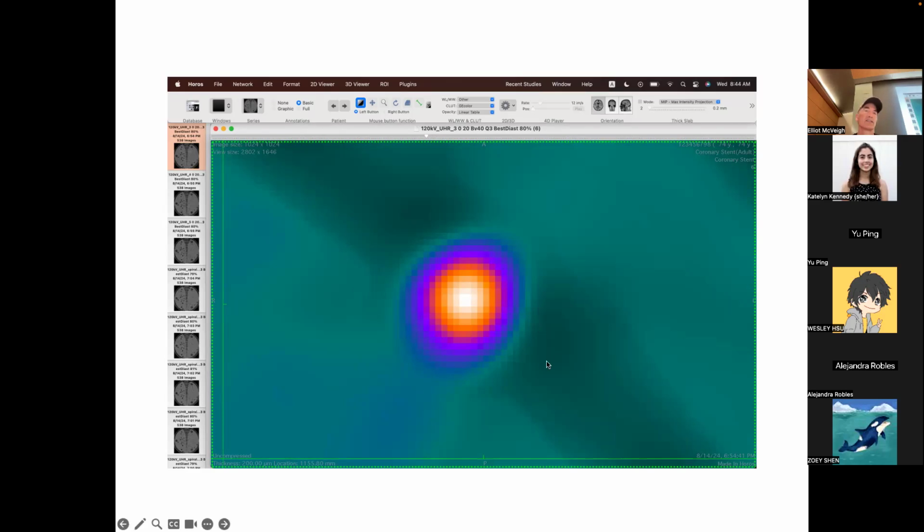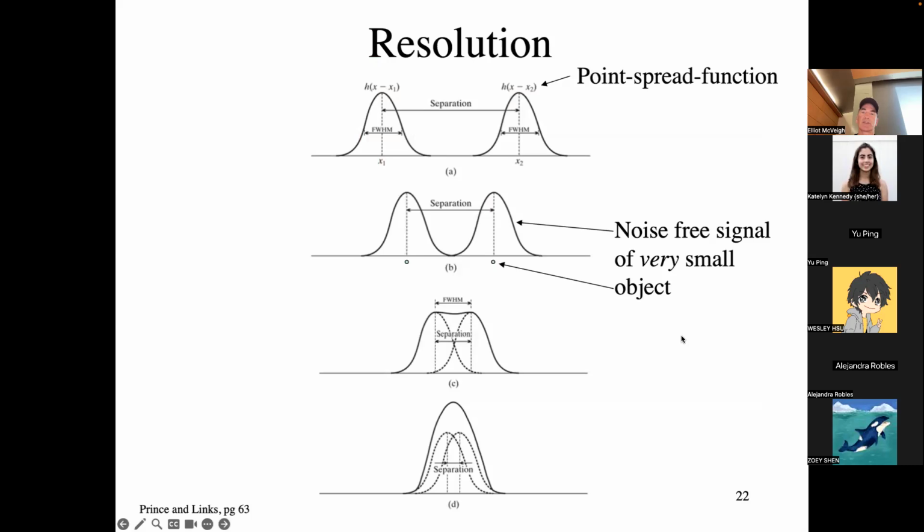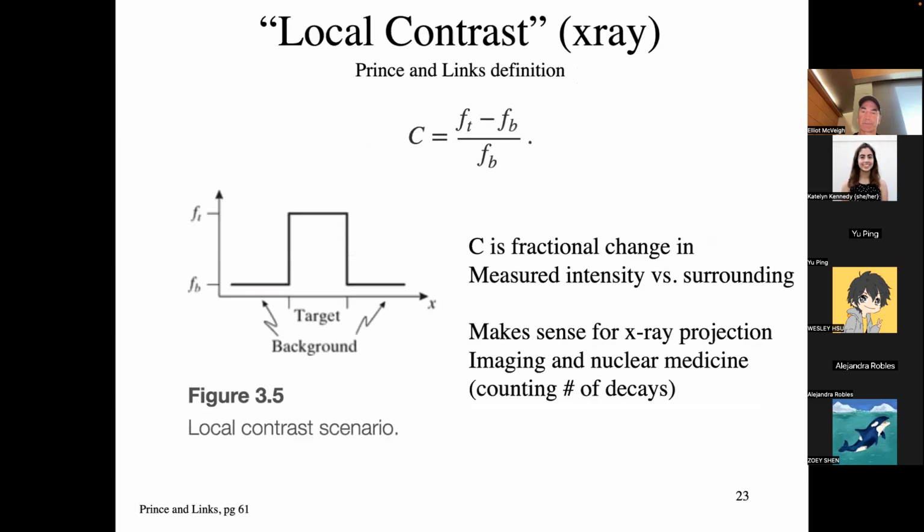Okay, so this is an empirical point spread function. You put an object in the scanner, image the object, and that's what comes out. So you measure it, right? And just directly measure it. And you basically do this experiment where you have an object here and you measure this function. You fit that function to a Gaussian, and then normally you say, what is the full width at half maximum of my Gaussian? And that gives you a dimension that's in millimeters or some sensible unit, right?